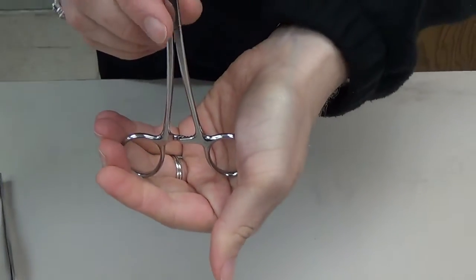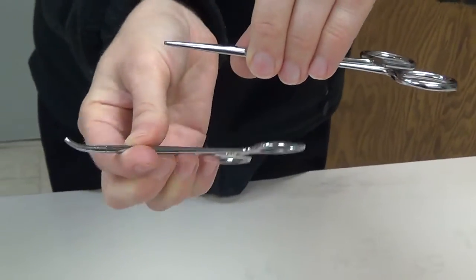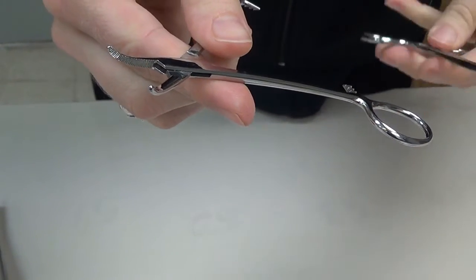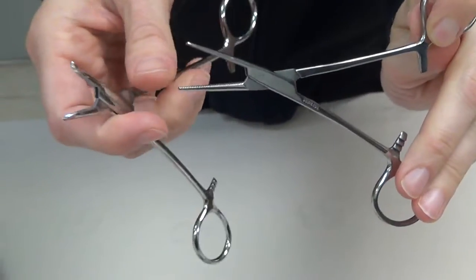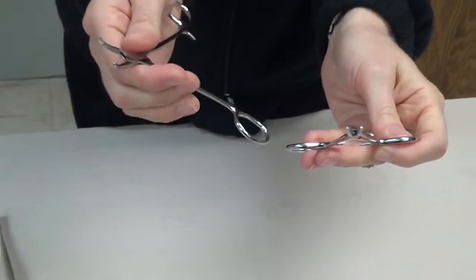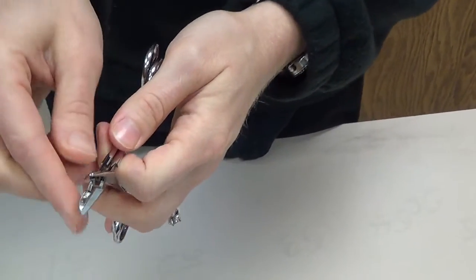The mosquito does come curved and straight. The serrations on the inside go all the way from the tip down to the box lock. The mosquito only comes in one size — it's very small and therefore utilized with very delicate, fine tissue. You might see it used on hands, feet, on the face, or any small anatomy areas where the blood vessels and structures are going to be very fine and delicate.